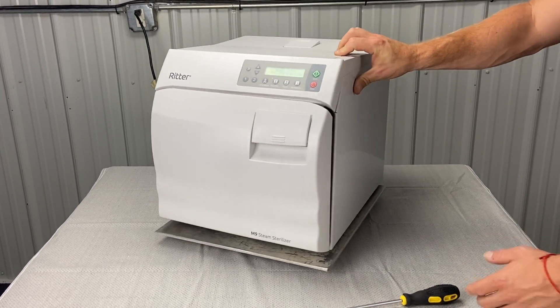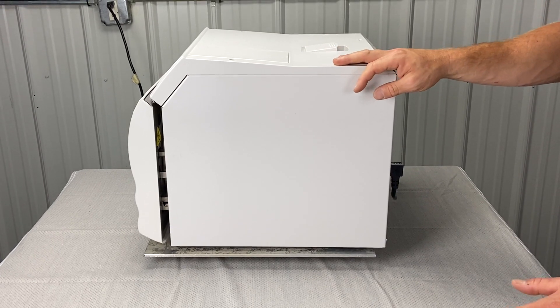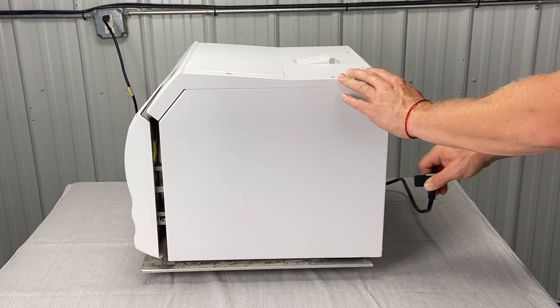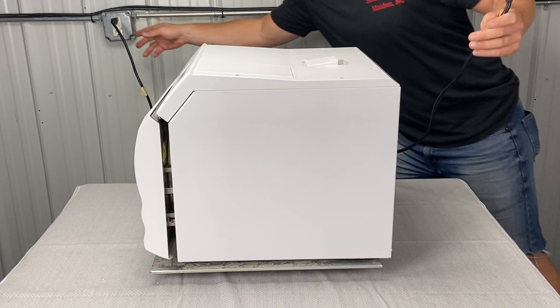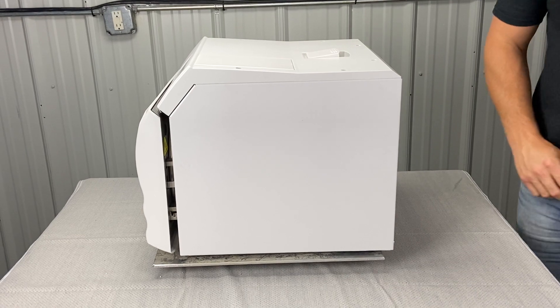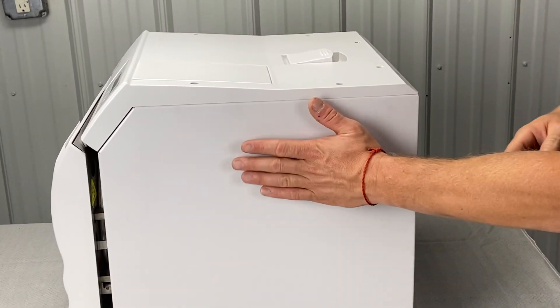First, you're going to need a Phillips screwdriver. Second, we're going to need to unplug the unit from the back, and then also unplug it from the wall and discard the power cord aside. Then we are going to take this panel off.